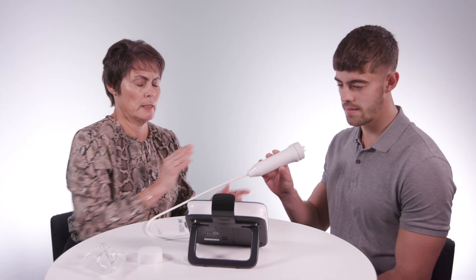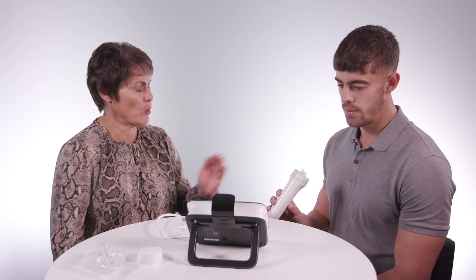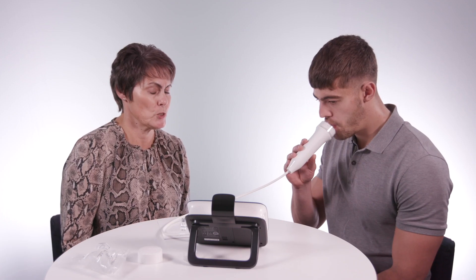We've got a nice clean mouthpiece on the top for you, and I'm going to pass you the breathing handle. So, as I say, three easy steps. First thing you're going to do is breathe all the way out and then pop that in your mouth for me. That's good. Breathe all the way in — you can see the orange light lighting up along the bottom. Just let your lungs fill. That's it. Start to blow out.